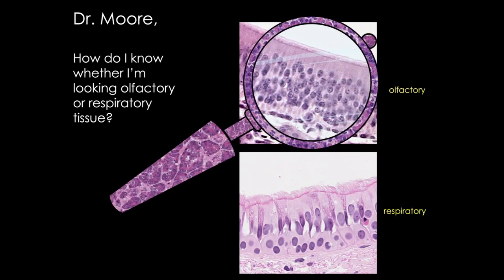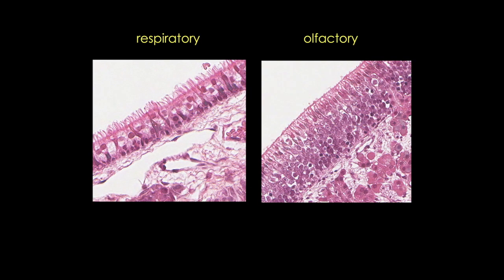So let's investigate. In routine H&E stained slides, olfactory tissue resembles respiratory tissue. Both are found in the nose. The tissues are eosinophilic and both contain large numbers of ciliated cells. The lamina propria of both of these tissues contains glands, although olfactory typically has more. But without other cues such as location or special staining for olfactory sensory neurons, identification isn't always easy. But there are several things that might help you tell these tissues apart.